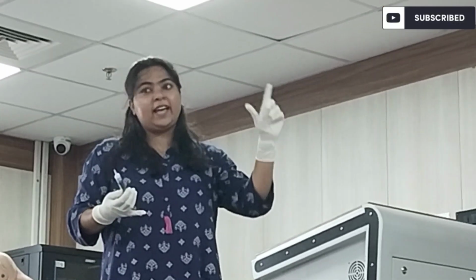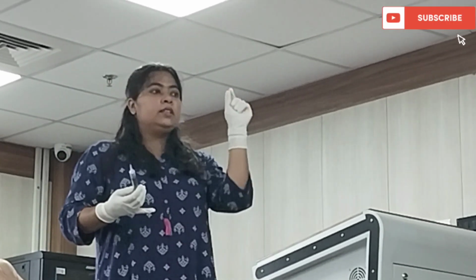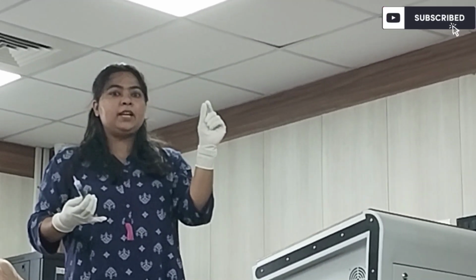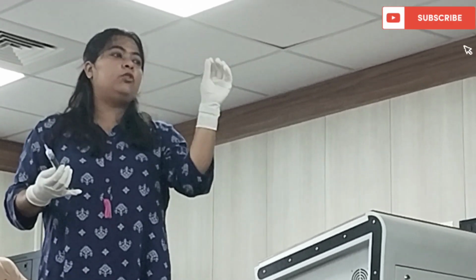Before going for the blood drawing procedure, you have to label your vials. And some things are important. The PGTs will tell you that your name, the registration number, these are unique to the patient. So at least the name, bed number, and the registration number you have to write. Label the vial beforehand, before going for the sample collection, because after this, there will be some dribbling, as sir has said.